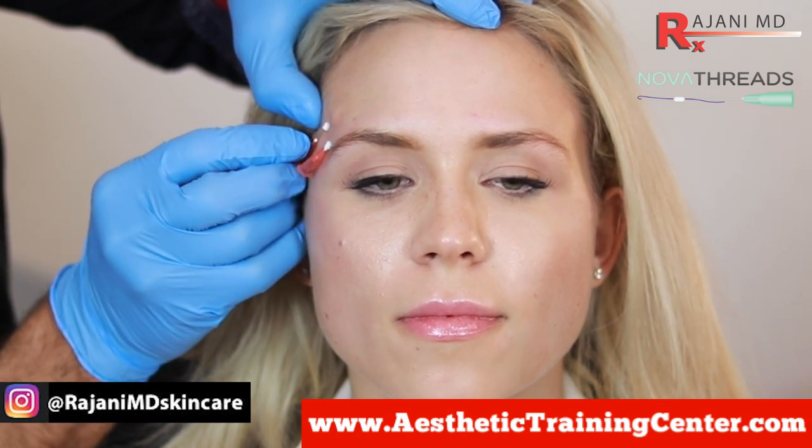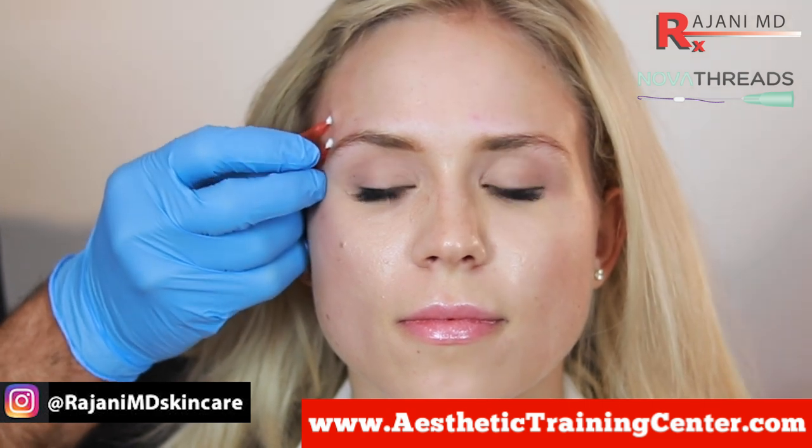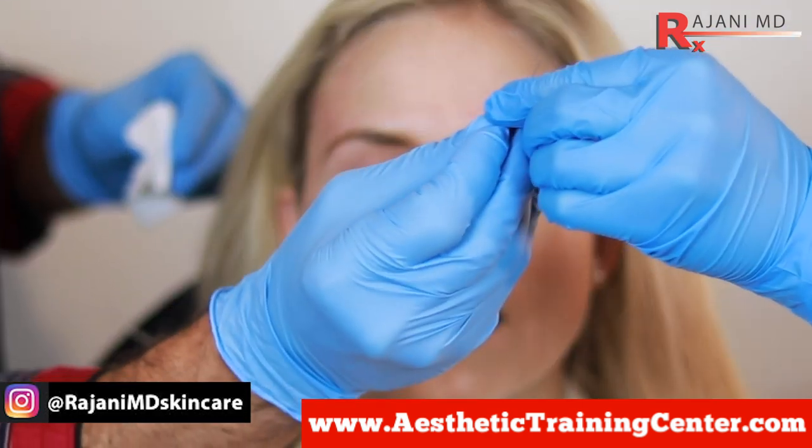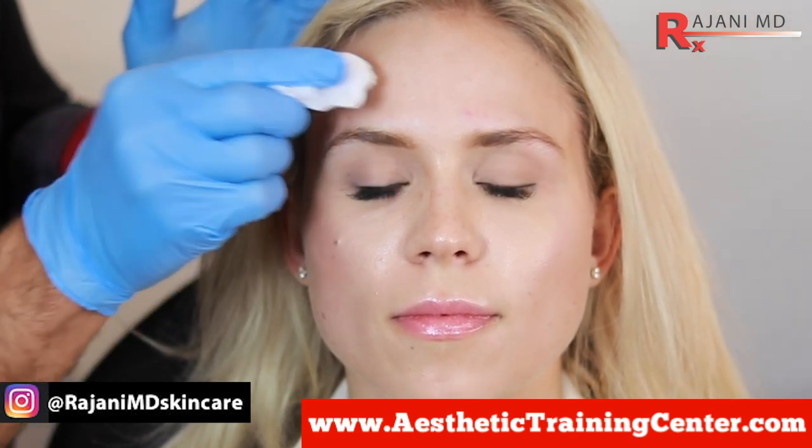You can only do the best you can because it's a little bit of tiger country and there are a lot of vessels in this zone. But the nice part is if you do see a little bit of bleeding, pressure usually stops it. So that's one out. And then the second one — not a drop of blood yet. The threads engage when you pull them, put them in and push them out. They self-engage. It's a nice little ingenious method to add collagen stimulation above the brow to give it a little bit of lift.